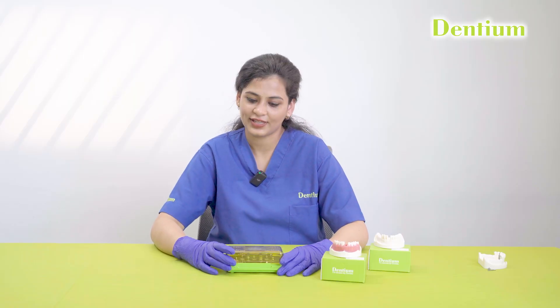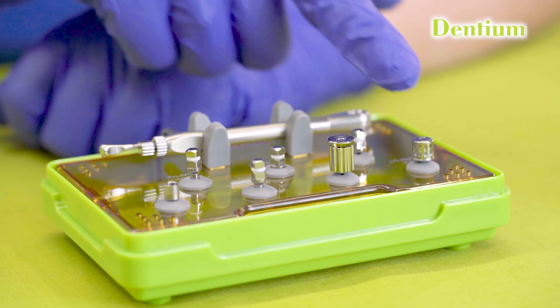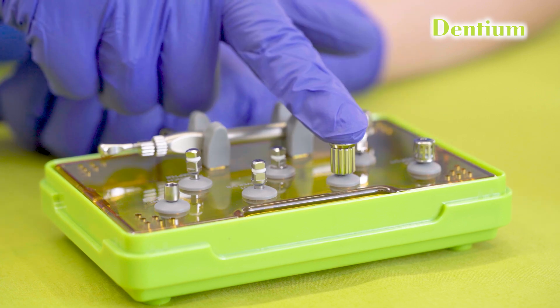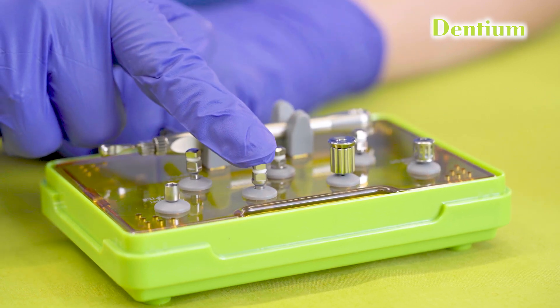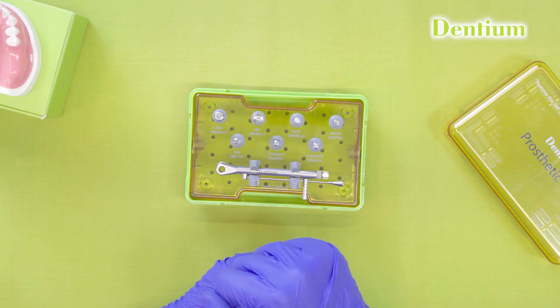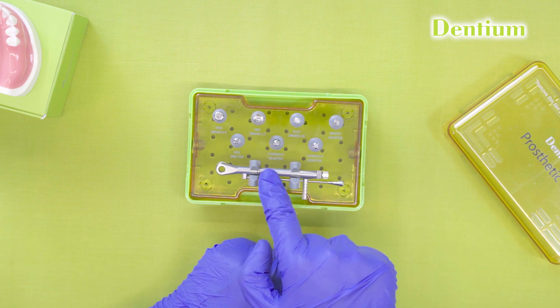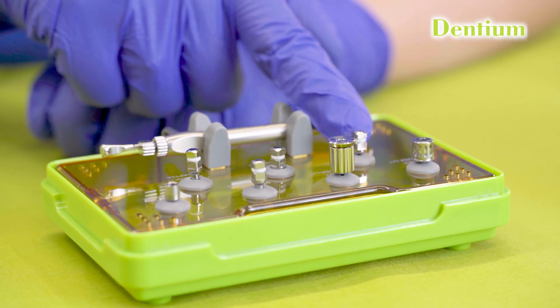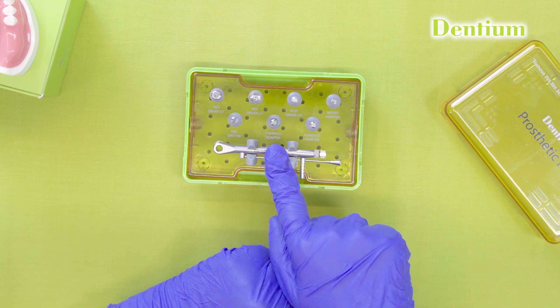Let's open the Dentium prosthetic kit and look at the instruments required for the process. These are the hand-held hex drivers, available in two lengths: short and long. This is the slot driver, which is used to remove a tightly seated healing abutment with the help of the torque ratchet. This is a torque ratchet driven hex driver, which is placed inside the torque ratchet.